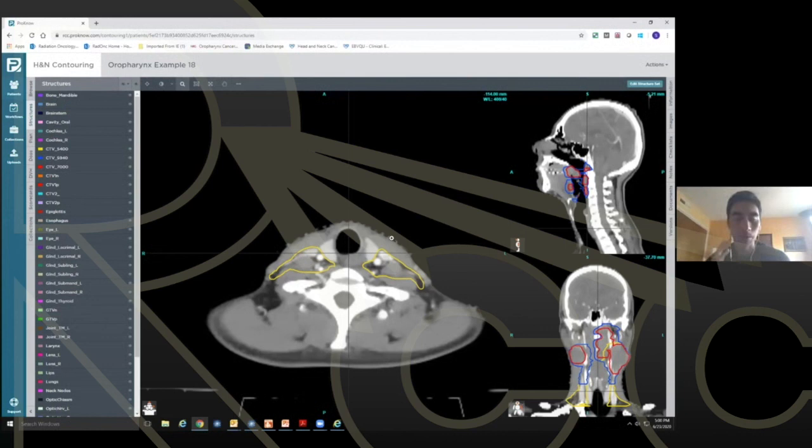And do you use physical exam to help guide you in that decision? Actually, I think what I use is I look at their most recent imaging. That's right. So I would use the physical exam and recent imaging. It's always ideal if you have the option and have access to MRI. I like, for definitive cases, also using a treatment planning MRI. And that really helps even better delineate extranodal extension.